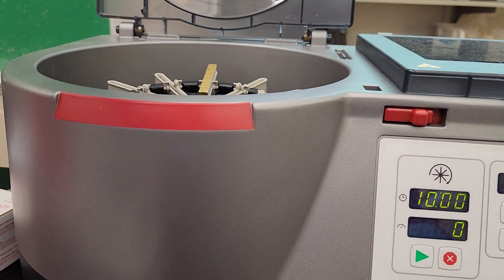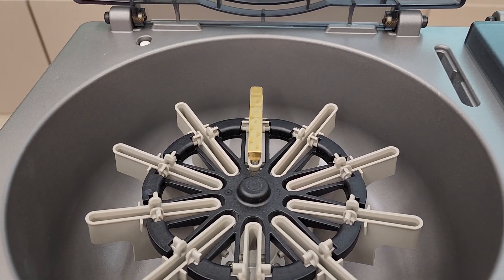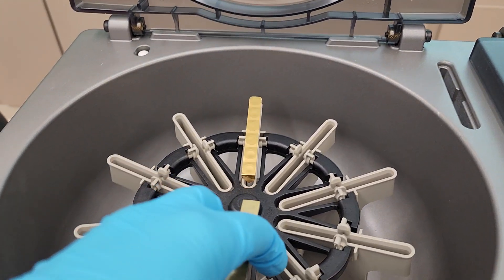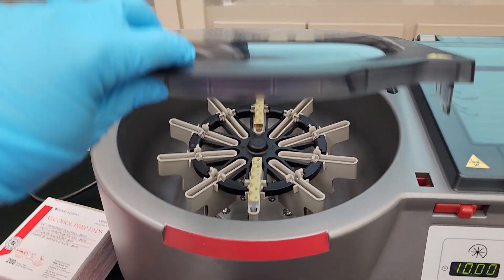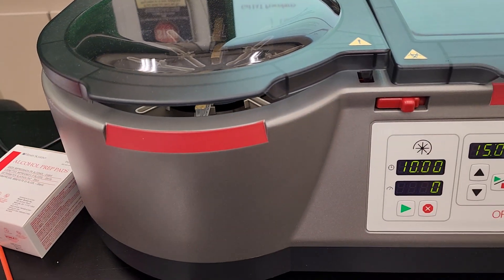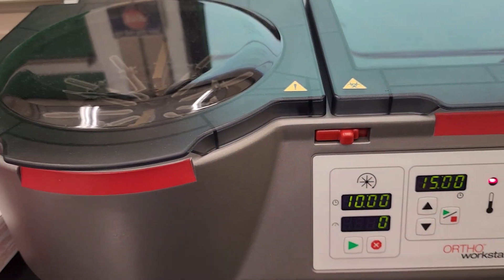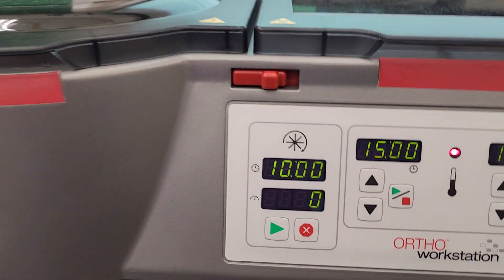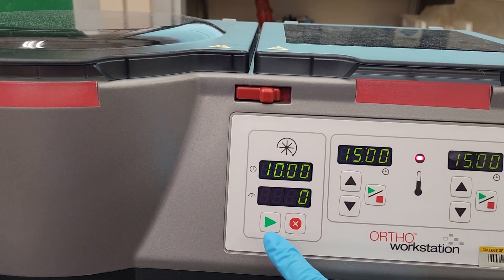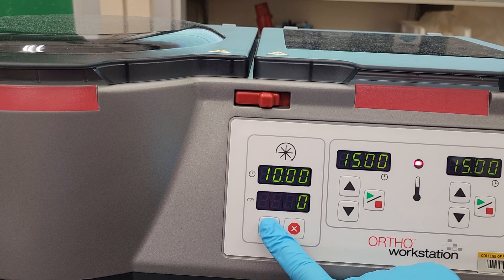Even though I have my gel card in, it is a centrifuge, so you need to balance across the rotor. Close gently. It won't close all the way unless you slam it or move the toggle over to the right — I suggest moving it over to the right. Then we have the go button right here. You'll press go and it'll start to spin.